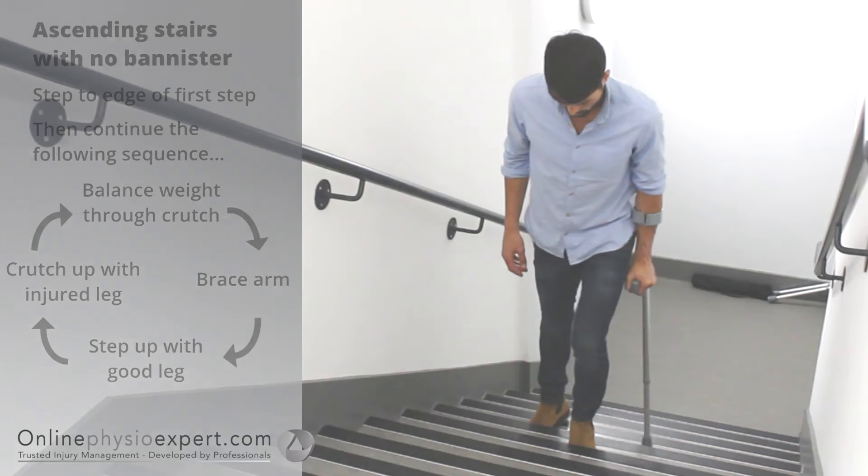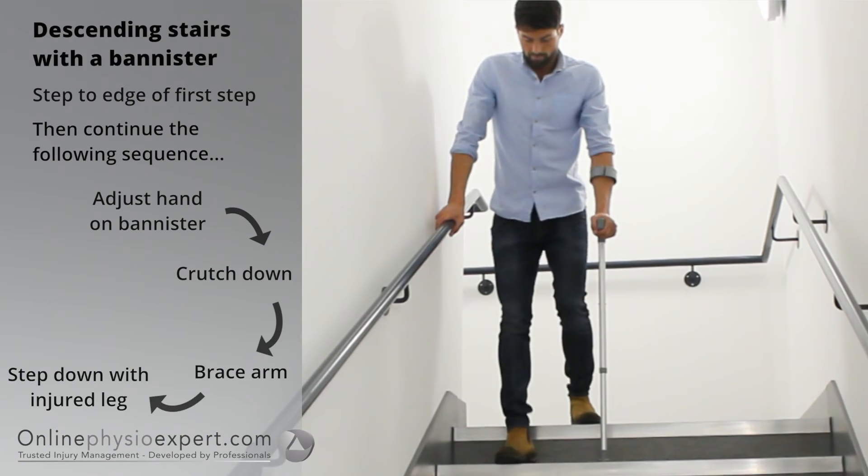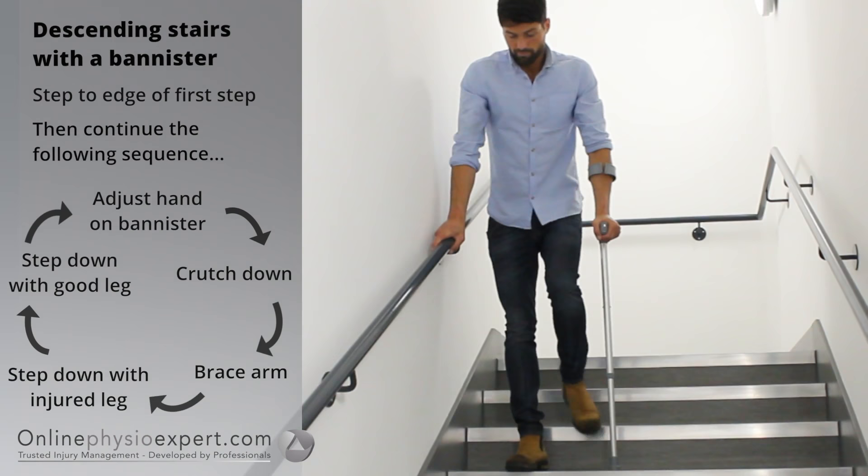To descend stairs safely, step your feet to the edge of the first step. Place your hand forwards on the banister. Place your injured leg and crutch down to the next step followed by your non-injured leg. Repeat these sequence of movements until you safely reach the landing.